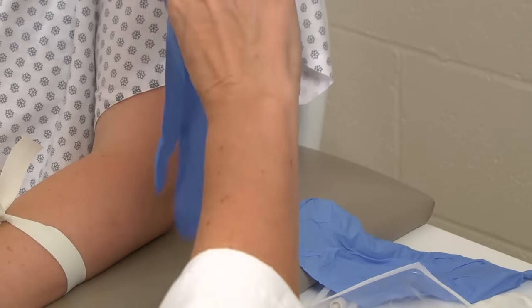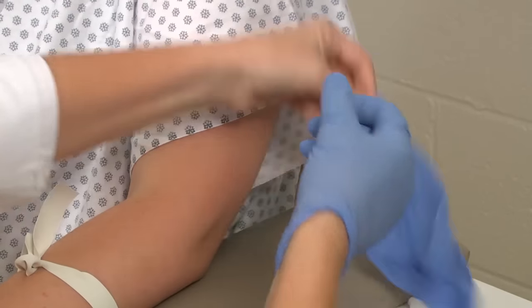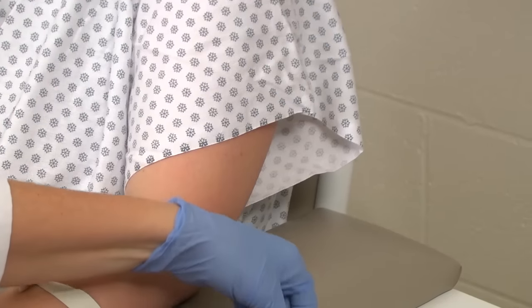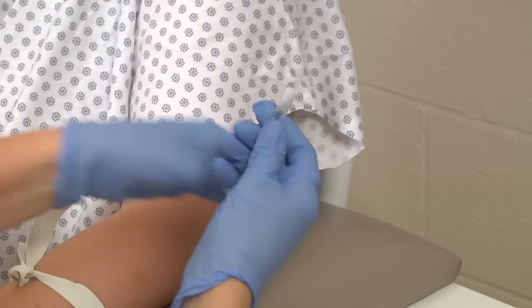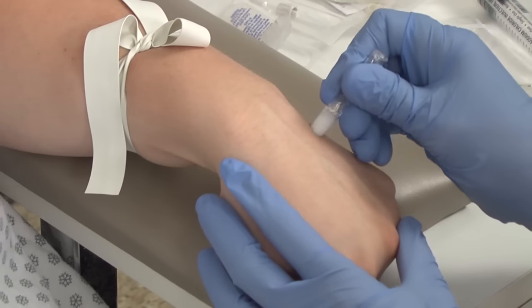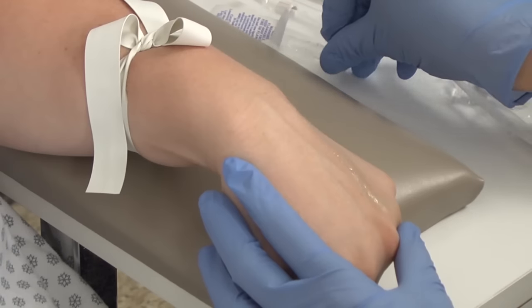Put on the non-sterile gloves, making sure they are latex-free if needed. Once you are gloved, activate your cleaning solution — often this is done by squeezing or cracking the container. Cleanse the site in the direction of the vein and dry as needed.